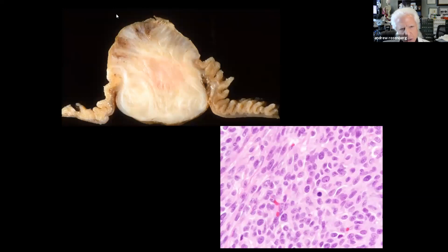I, as the surgical pathologist, receive the resected portion of stomach. I dissect it, and here is the wall of the bowel, and the abnormality is this large, solid, tan white mass that has ulcerated the overlying mucosa. I carefully sample it. I have a section of the mass under the microscope, and I can see that it is composed of many cells.